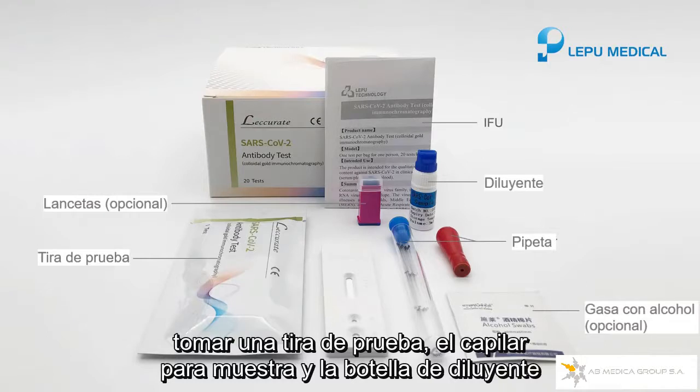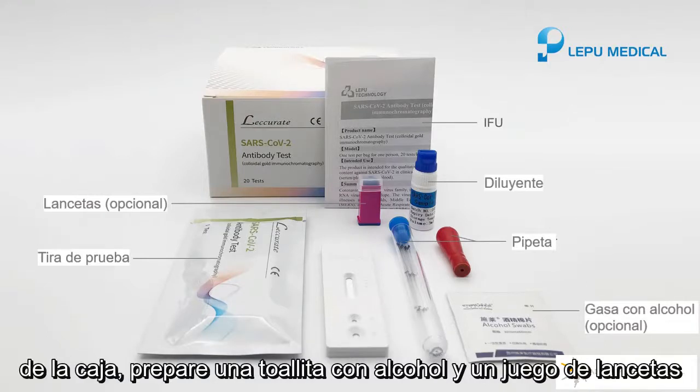Take one test card, one dropper, and a bottle of buffer from the box. Prepare one alcohol swab and one lancet.